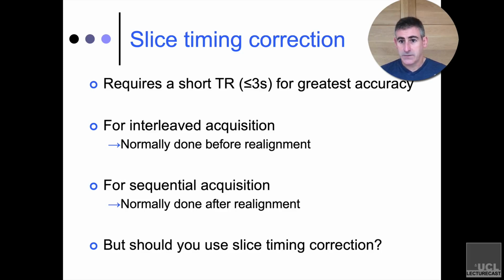They are removed through some sort of image preprocessing, or modeled when you're doing your statistics. That is to say, use the right statistics to match your data. Don't change your data. For our purposes, we need to change the data to deal with the issue of motion realignment, spatial head movement.